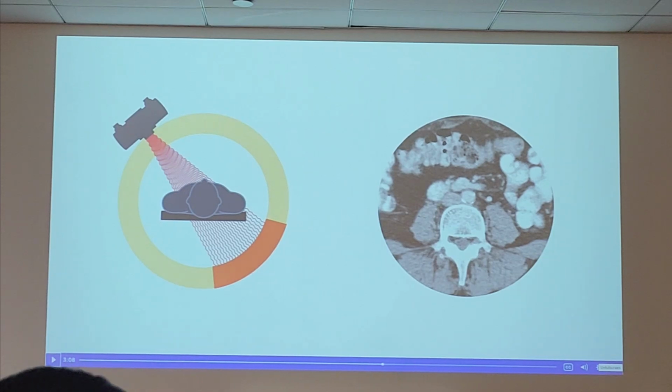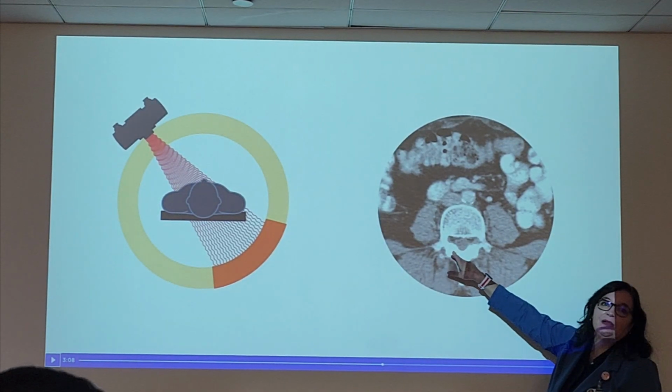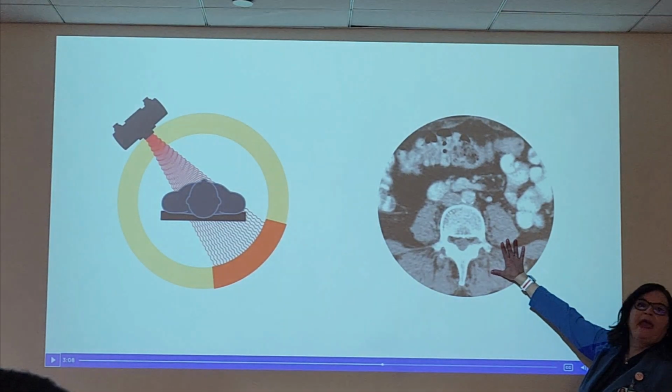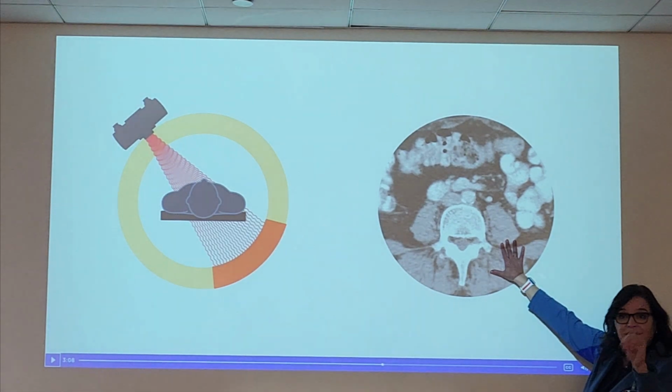When you see white, you just see a vacant spot on this image because no X-rays made it through this portion of the body. It's absorbed, it's blank, it's a blank slate. Think of it like a canvas. If you don't paint on the canvas, it stays white, correct? It's void of any information.